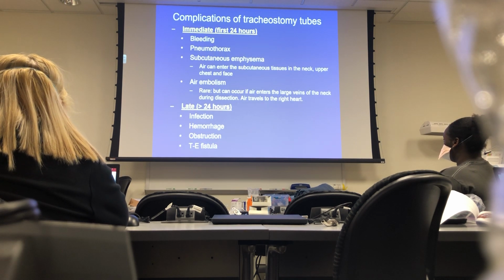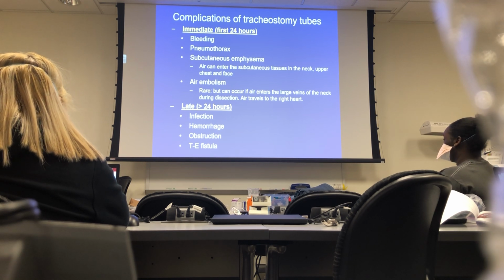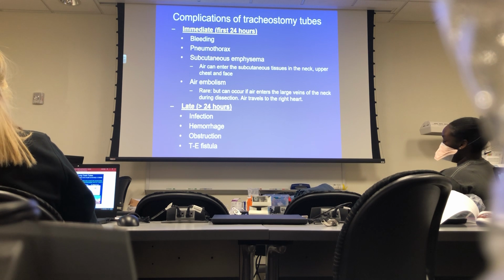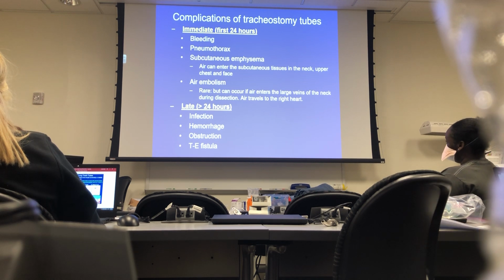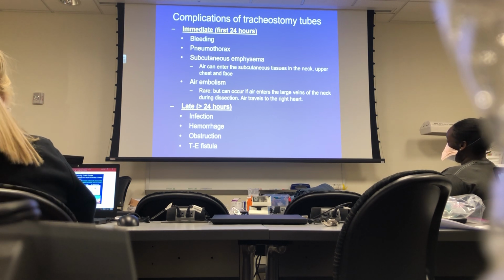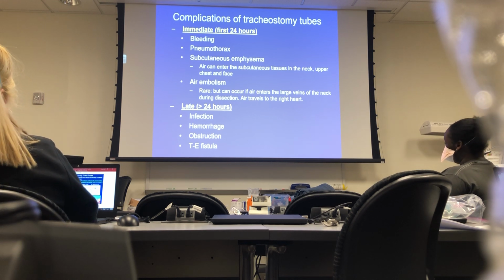Okay, so complications, when they first put in a trach tube, of course bleeding, in the first 24 hours. When a trach is put in, the surgeon comes around the next day, and he says, any trouble with the trach? He's wondering, how's the bleeding look? Was there a pneumothorax? Is there any subcutaneous air around the site? So it's nursing and RTs that will look at that as part of your airway care when somebody comes back with a fresh trach, okay? Air embolism is rare, but that can occur.